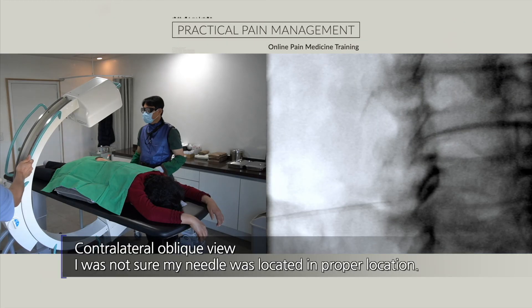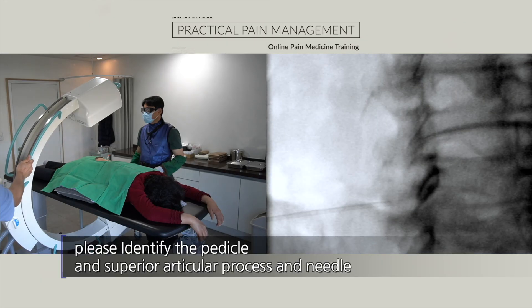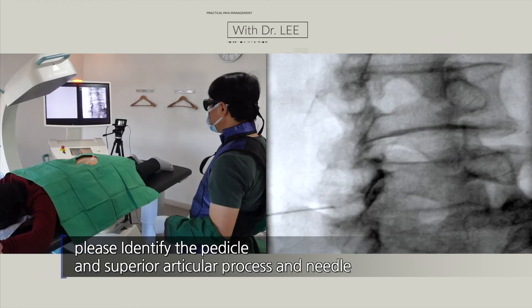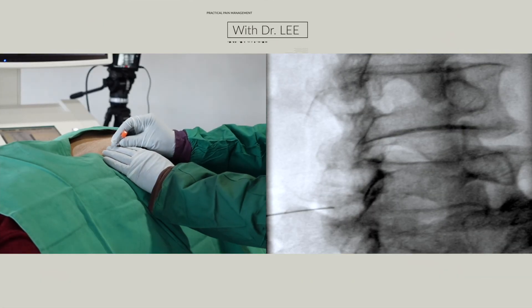I was not sure my needle was located in the proper position. Please identify the pedicle, superior articular process, and needle.